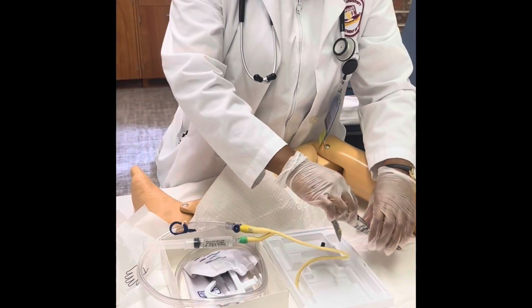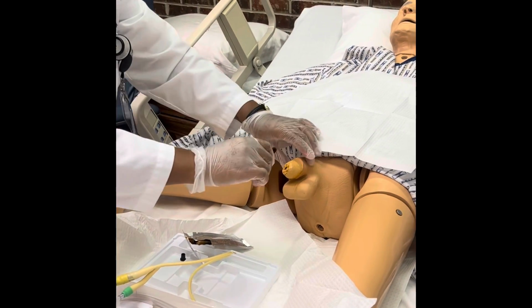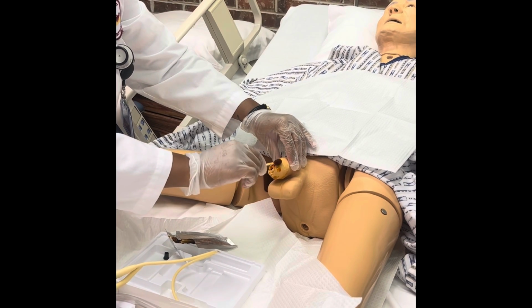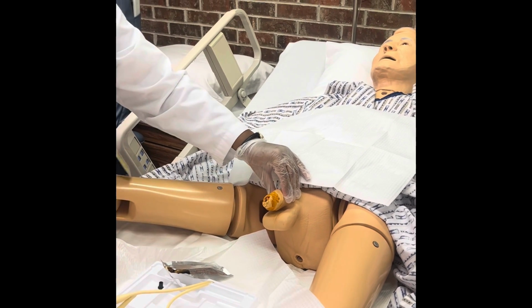Now I'm going to clean with iodine solution. One Q-tip at a time. With women, you would go side, side, middle. With men, you just go around on different surfaces. Clean as much of the area as you can. Trash.